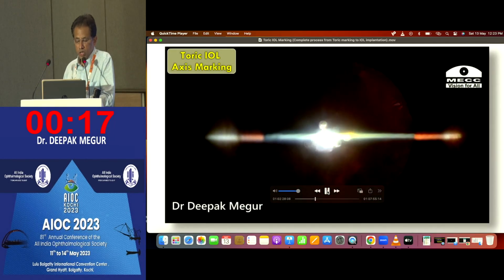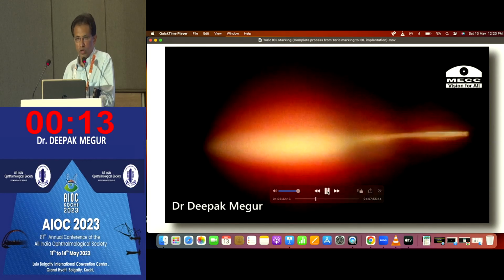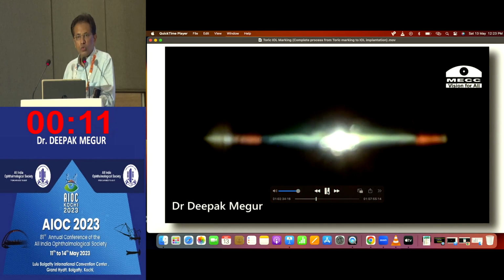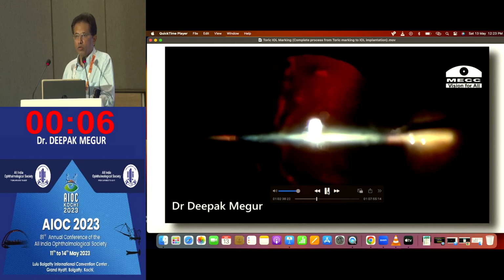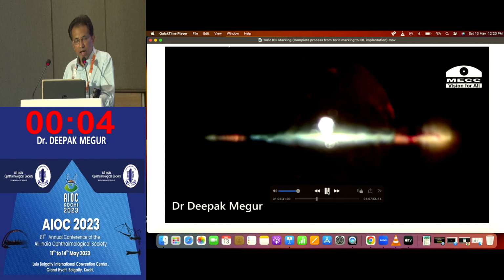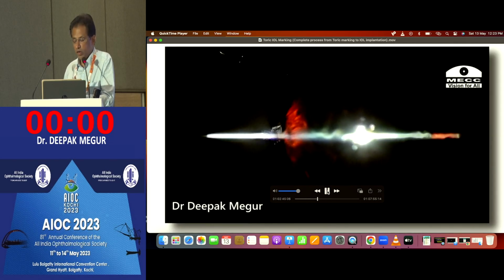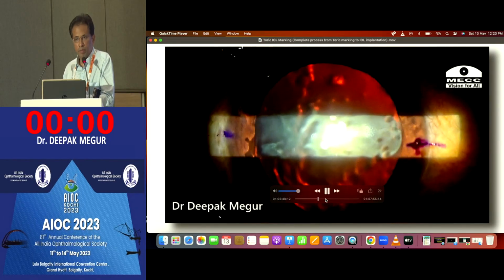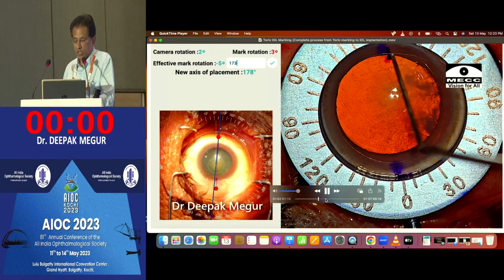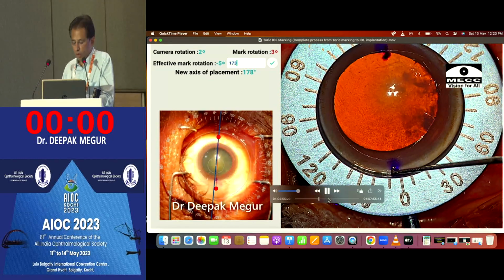And then maybe in those situations you can use this. So I always prefer to use the slit lamp marking over the freehand marking, just to enhance the accuracy and reconfirm by using an app. So either you can use an iPhone app, Toricam, or what we use is the Android phone, and you can use a Patwardhan iToric app. And I have found that the acceptability or the post-op accuracy is significantly better than your freehand marking.